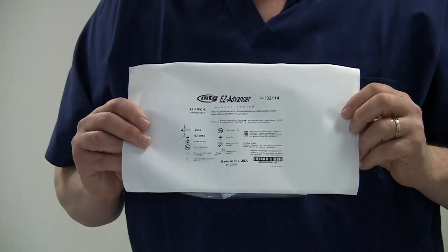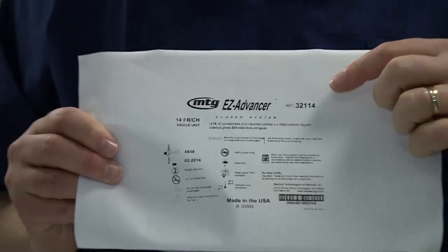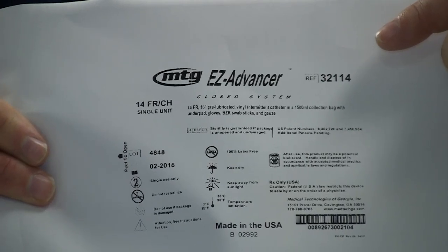Now let's have a look at Easy Advancer. Keep in mind the last two numbers in the reference number are the French size. In this case, 14 would denote a 14 French catheter. First, I'm going to show a demonstration of how to catheterize the male patient.